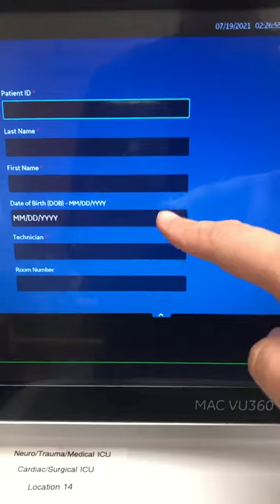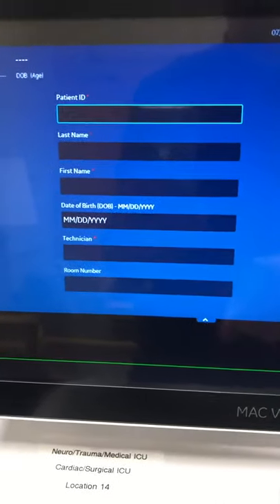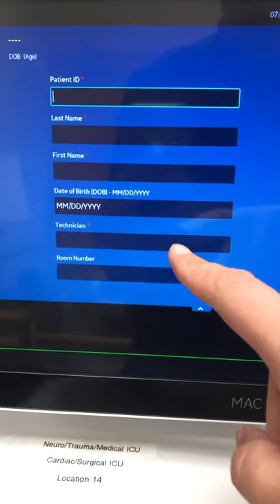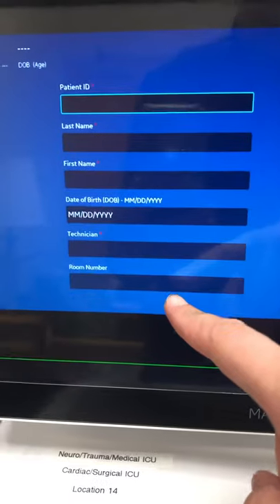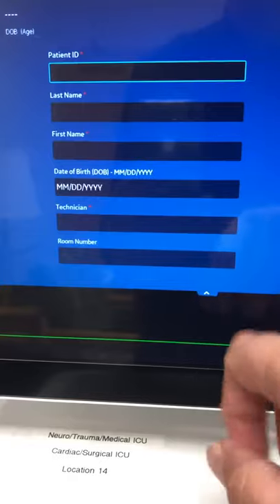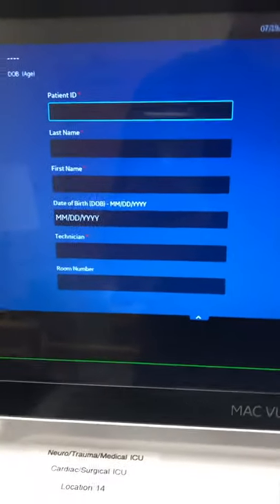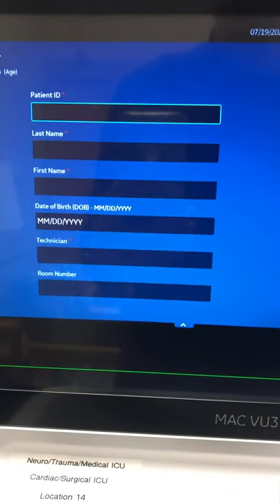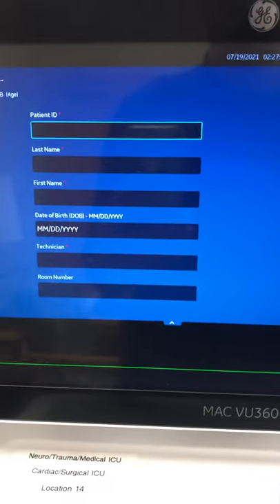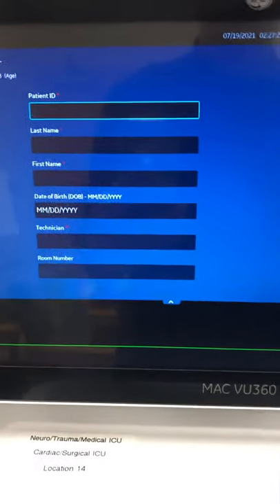If those fields don't autofill, you'll have to manually type them in with the keypad. The last two fields you also have to enter manually: your technician name, which is your AU or computer username, and the room number — for example, ICU 11, SI 23, CCU 10, or PCU 8 — whatever the physical location and room you're in. If you don't fill out all this information, it does not transmit to cardiac testing and your EKG order isn't complete.